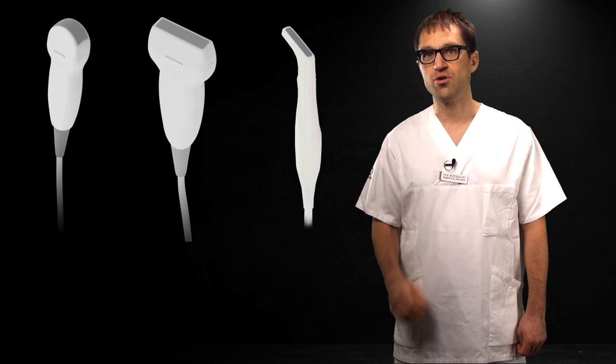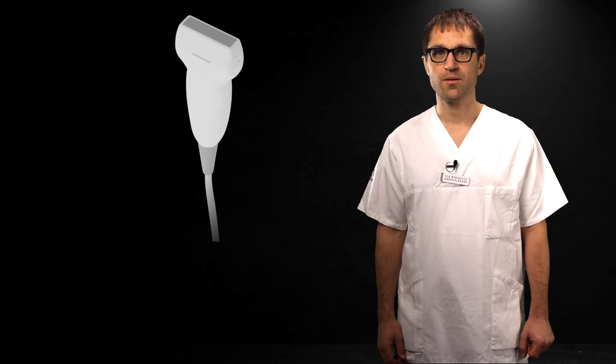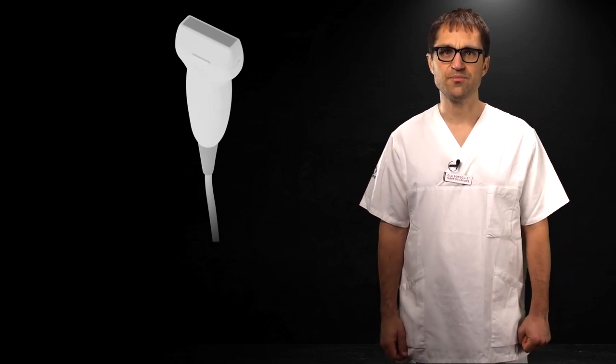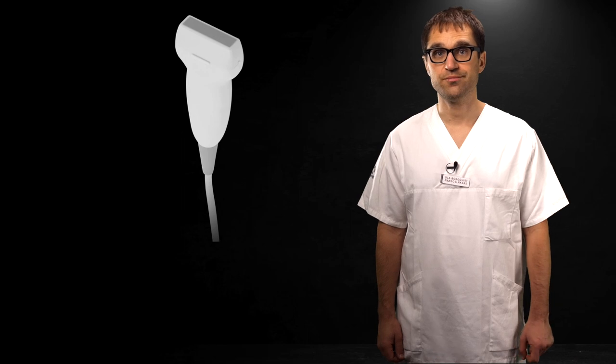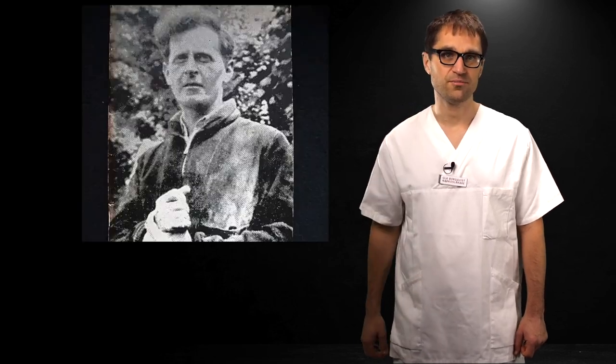Now you need to choose a probe, but all probes are not created equal and they all come with trade-offs. You're probably familiar with the linear probe. It's found on almost all machines. It offers a high resolution picture, but is usually limited in how deep it can see. It's generally a solid choice. The hockey stick is just a smaller linear probe with even higher resolution but shallower reach. It's mainly useful for jugular lines.